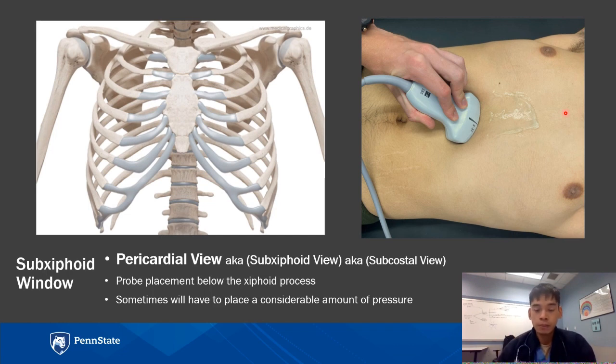As Dr. Goodmurphy has probably explained, the probe indicator should always be on the patient's right. And then you press down, and you're going to have to give a good amount of pressure, regardless of body habitus, and fan superior towards their head, fan superior towards their heart, okay? And again, we'll practice this in person, and you'll get a feel for it. But this is just to orient you about the different types of terms that we use and how that can relate to probe placement directly, okay?